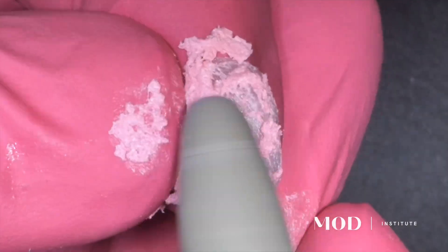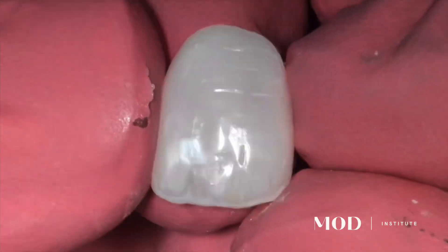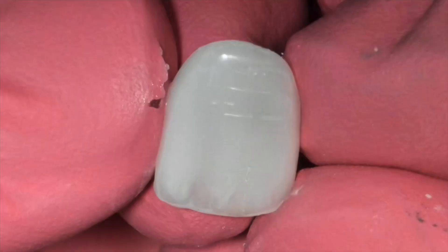We also have the advantage of a glycerin cure, so we can go ultra-high shine because it is a beautiful hand-polished resin material. With this Mod Polishing Kit, or your other favorite polishing kit, you can take it to an ultra-high luster that is going to be durable and beautiful.